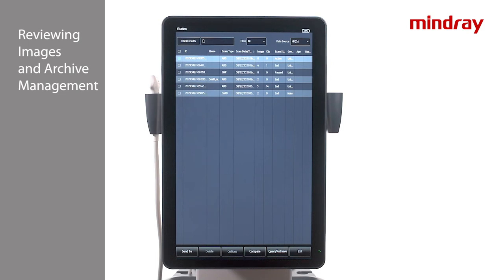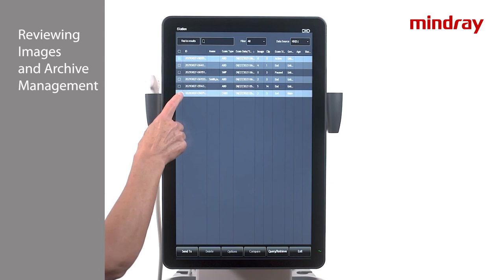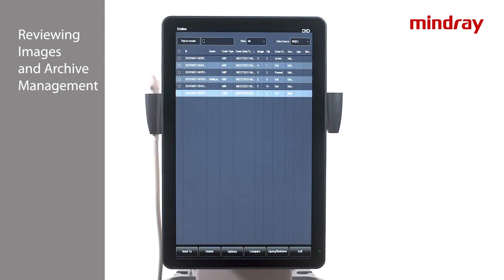Select iStation to access the exam archive with a list of all prior exams. Review, delete, or send past exams from this page. The TE7 provides the ability to reactivate an ended exam to add images or to update patient demographics.